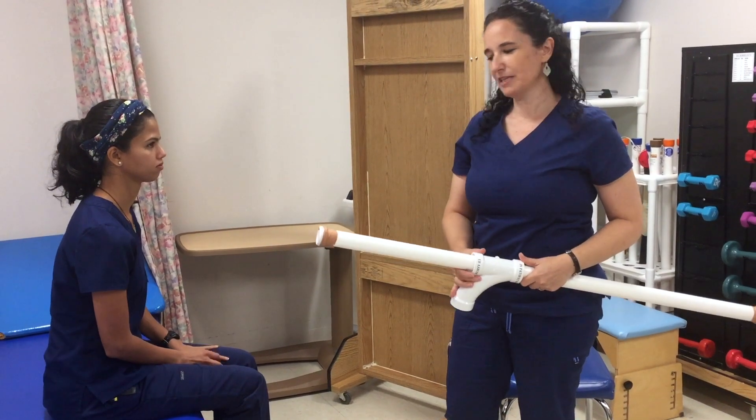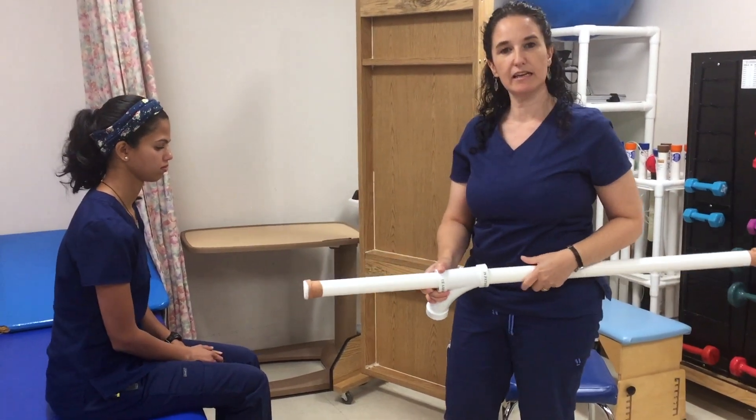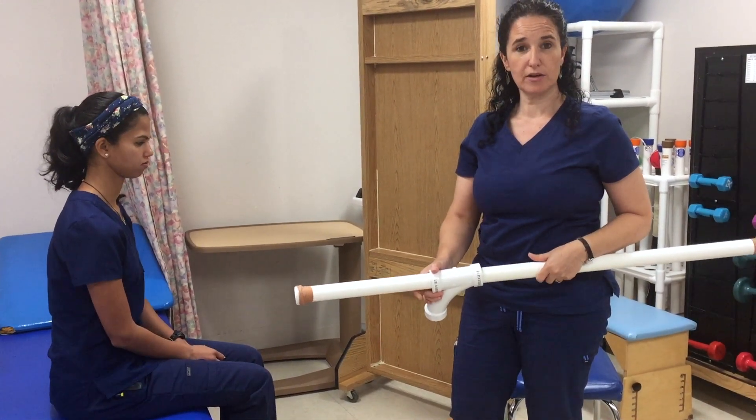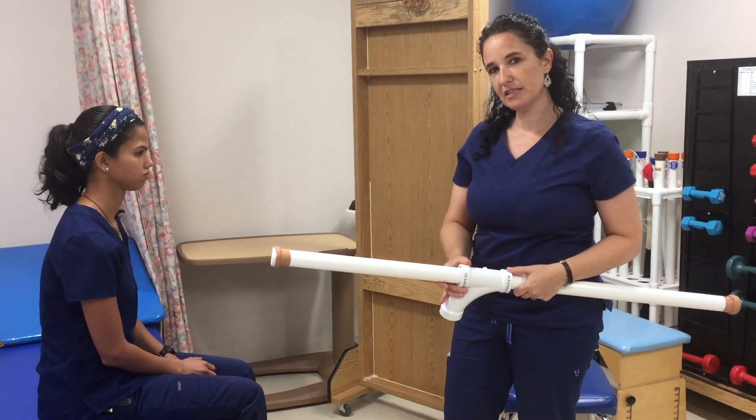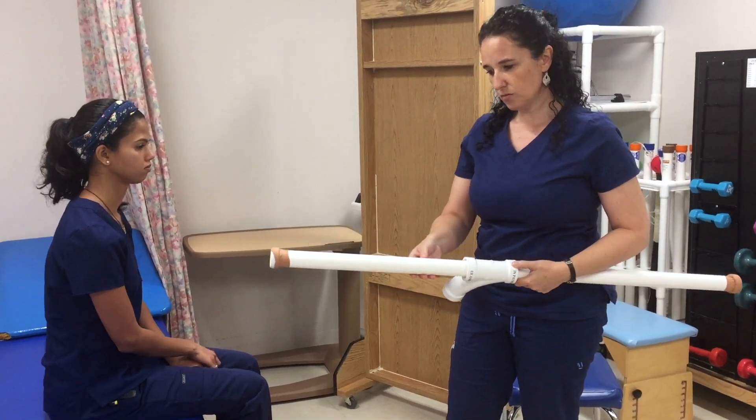So I have some interesting treatment ideas today. As you know from the evidence, early and intensive practice is very important when recovering from a stroke. So I have put together a couple of things that I think you'll find interesting.